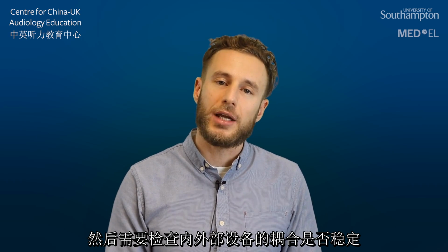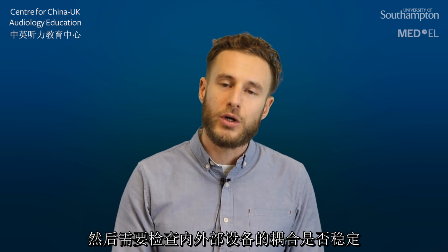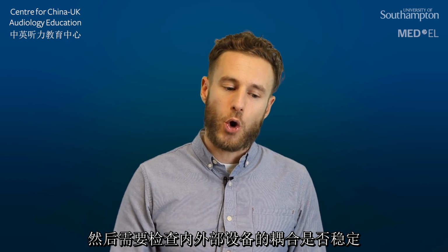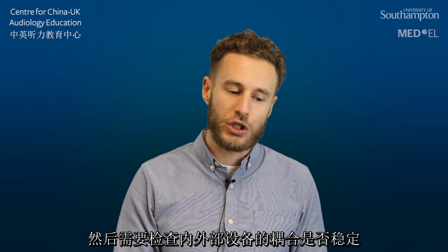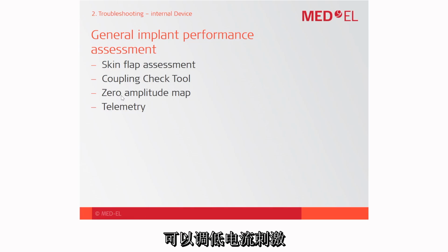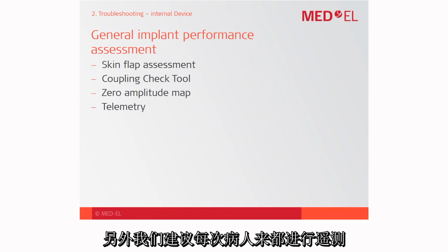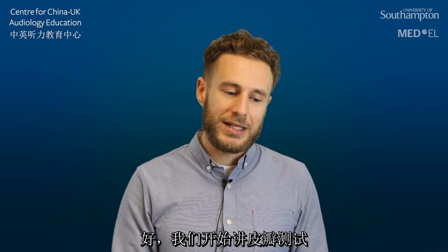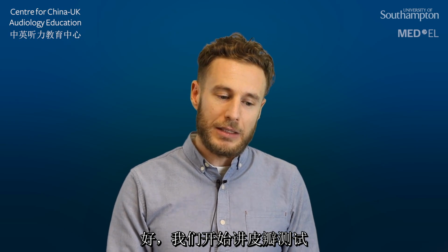Then the coupling check could be used to ensure that the inductive link between the external coil and the implant is sufficient. You could perform a zero amplitude map if the patient reports pain or discomfort. And for sure, whenever a patient is seen, we recommend to carry out a telemetry measurement. Okay, so let's start with the skin flap assessment.